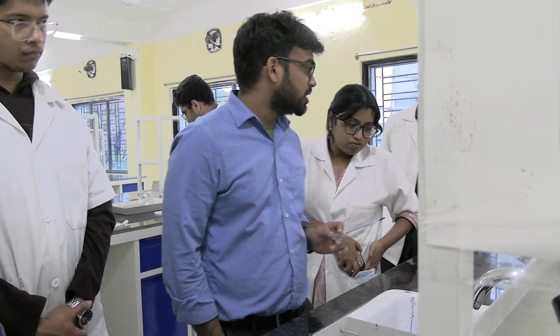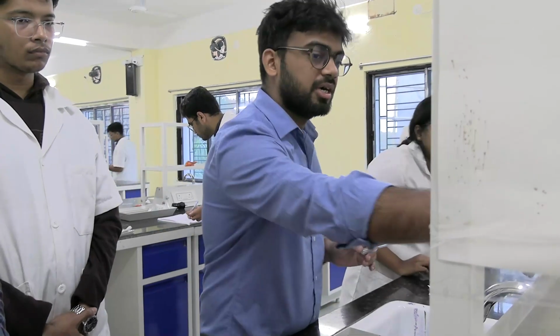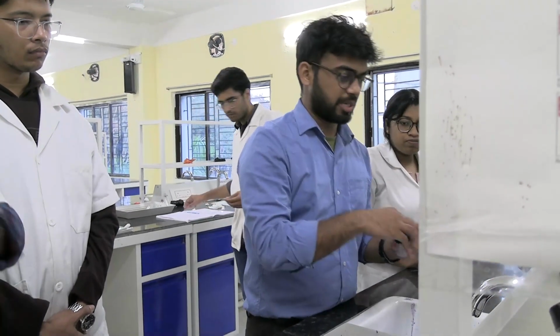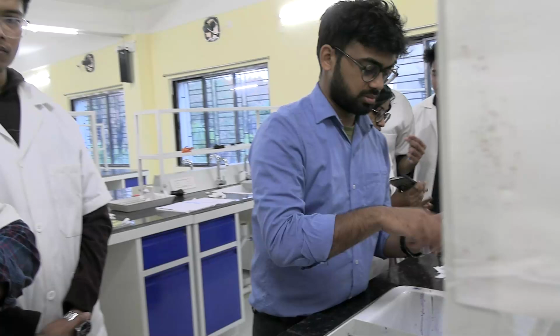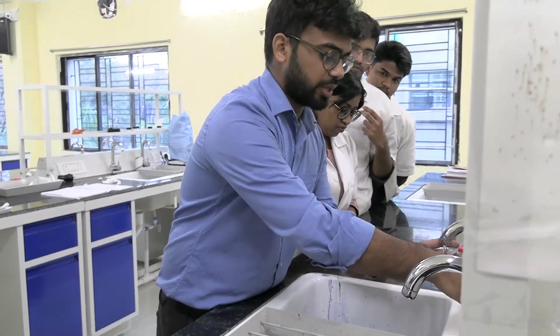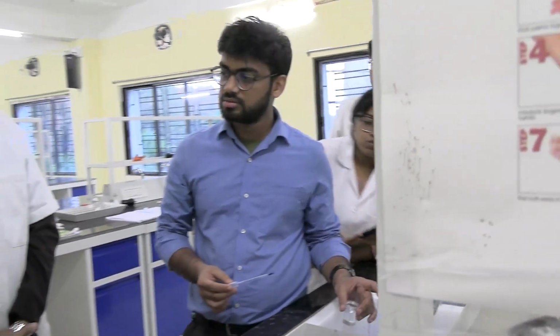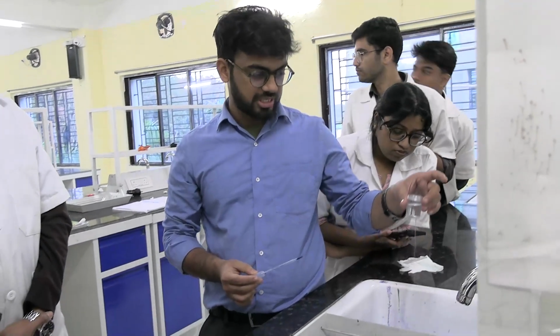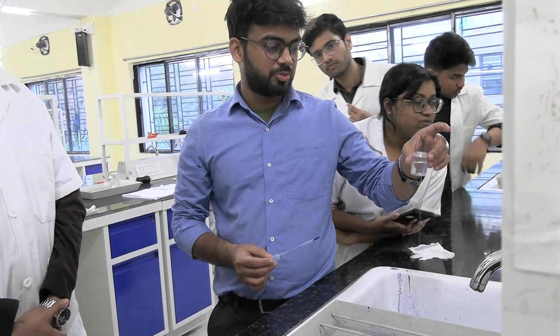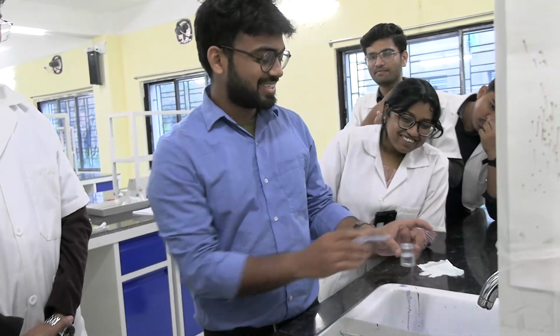Okay. Next, we are going to use water. Do you have distilled water? We don't, so we are going to use this tap water. How much time has passed? 30 seconds. Why are we using water here? Tell me. Has our time finished? 15 seconds more. It's leaking, just like the information in your brain. Whatever I pour keeps falling out.